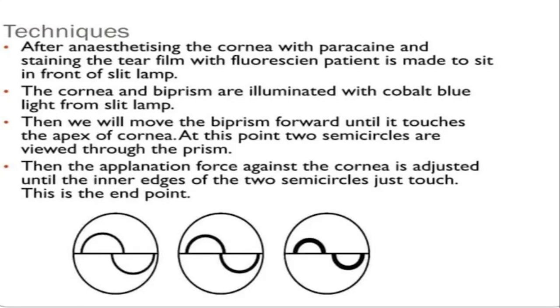It is important to note that Goldmann applanation tonometry requires a skilled operator and can be influenced by factors such as corneal thickness and hydration, which can affect the accuracy of the measurement. Additionally, it is important to take multiple measurements over time to account for any variation and to establish a reliable baseline measurement.